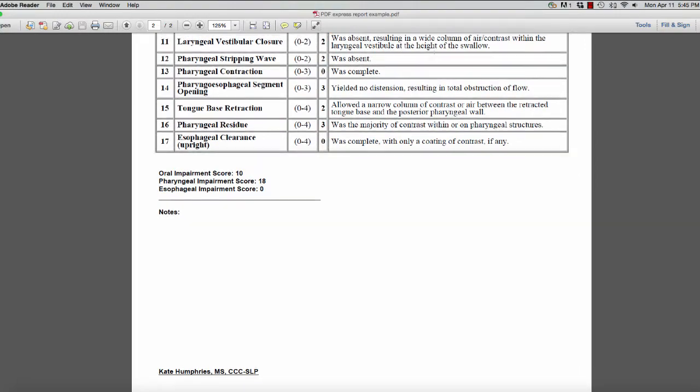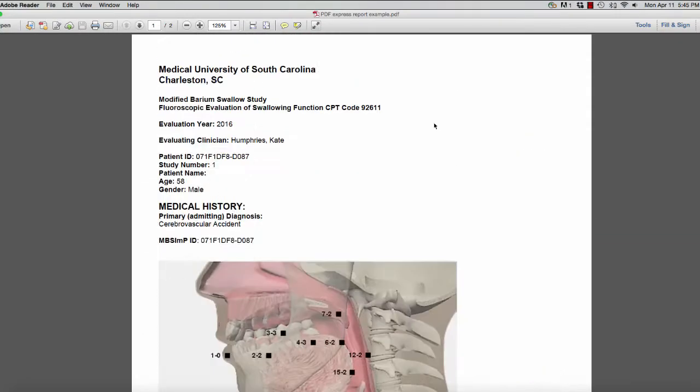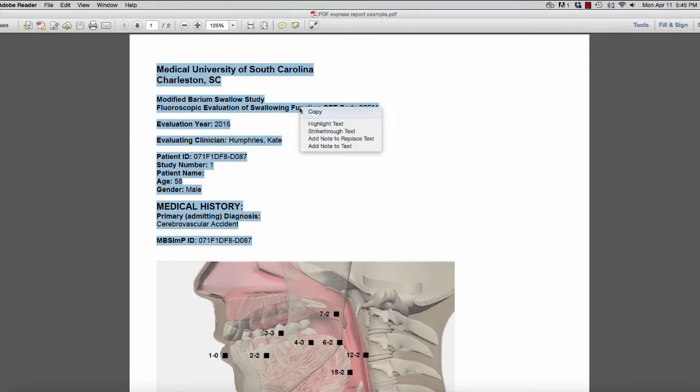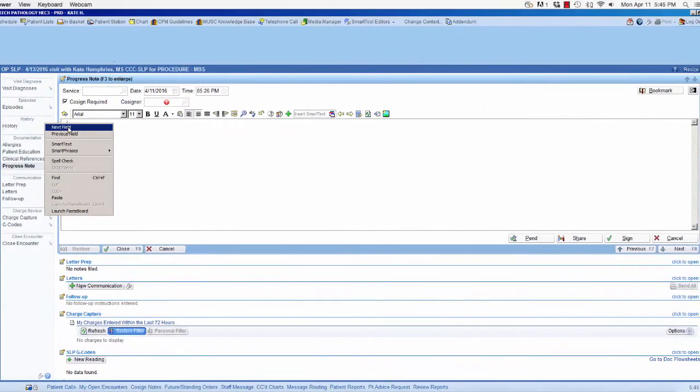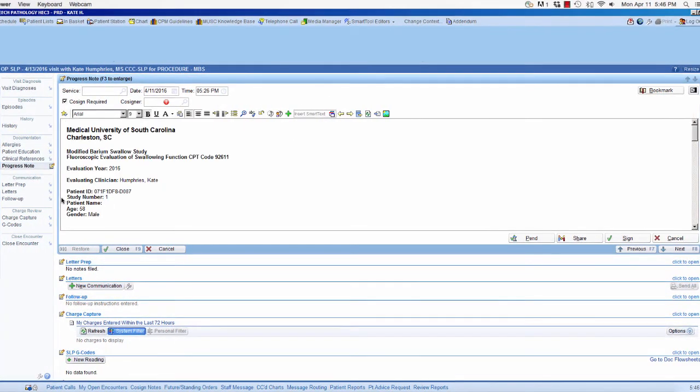Once you have reviewed the PDF file, it can be emailed, faxed, or copied and pasted into compatible electronic medical records.